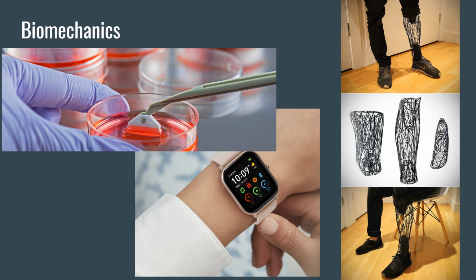Even amongst aluminum and other commonly used materials for building prosthetics, titanium is an ideal metal with its lightweight capabilities, as it can easily handle the forces required of it to perform everyday movements. As the three examples in this video showed, a strong lightweight material is needed, and titanium is one of the best options. Biomechanics is a massive field that has greatly improved the lives of millions of people. It extends from tissue engineering to prosthetics to smartwatches and phones, and the innovations from the biomechanics field touch the lives of everybody on this planet.